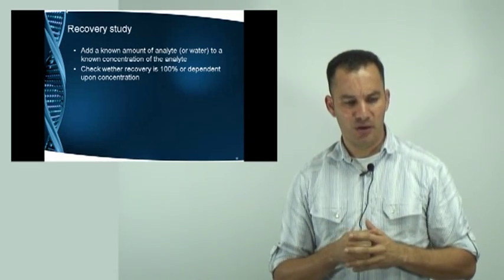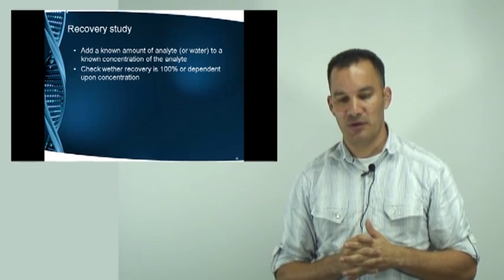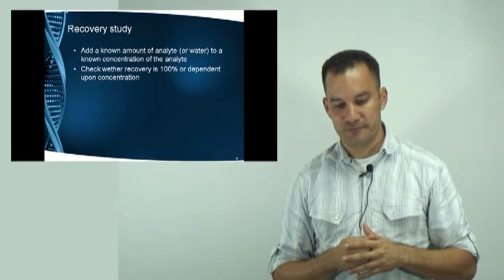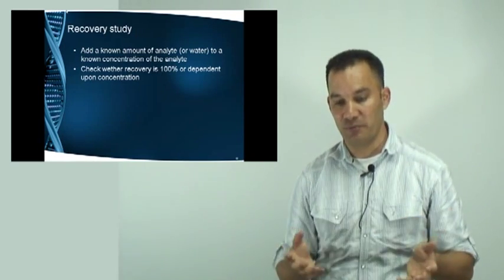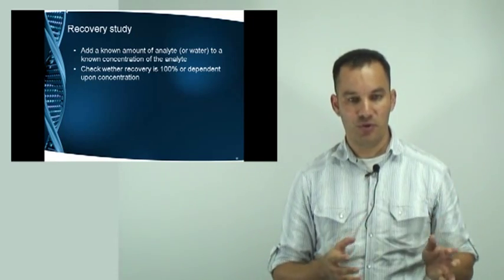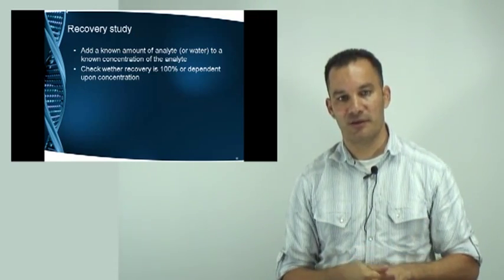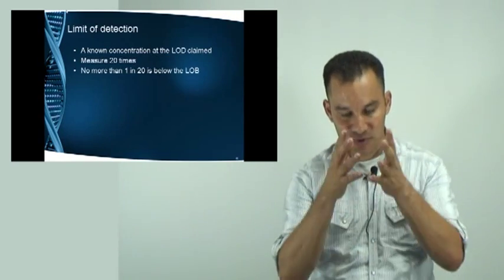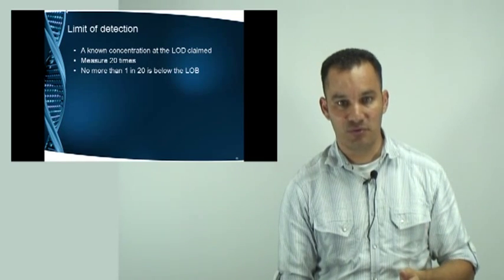Usually we do not perform this type of experiment here on the islands due to the fact that the analytes are usually not commercially available to us. Or you have to buy 10 grams of cortisol of which you will only use 10 milligrams, and the rest you can throw away because you will never use it again. So it has some practical issues, but it's an experiment which theoretically is very easy to perform.